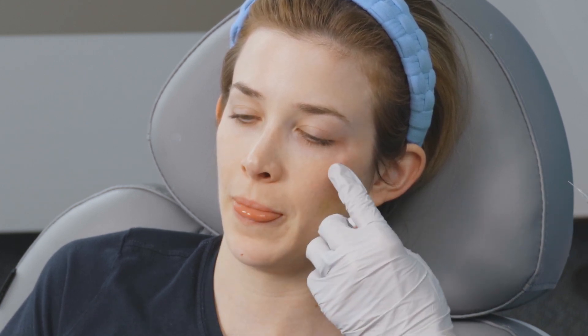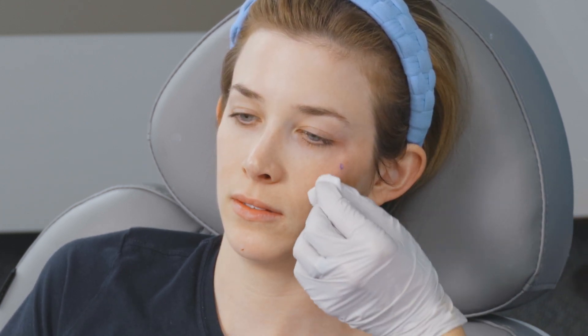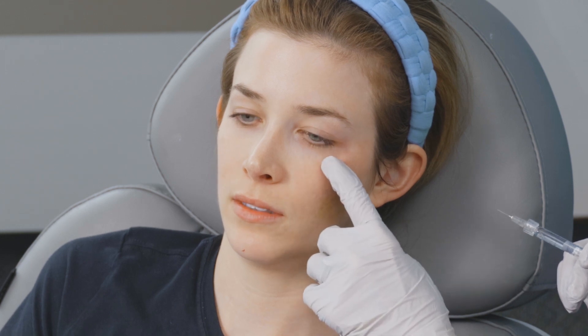You would do that for each spot you're going to inject. So if we want to put another drop right there, that's what we'll do next. So that is our safe map of that needle bolus on the cheek. Hope you enjoyed.